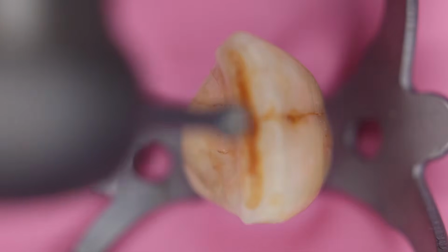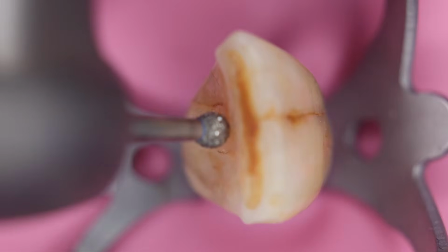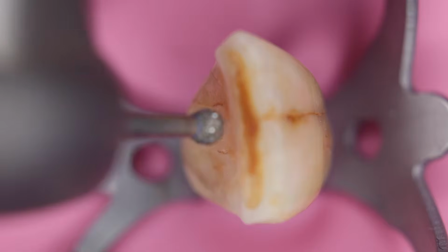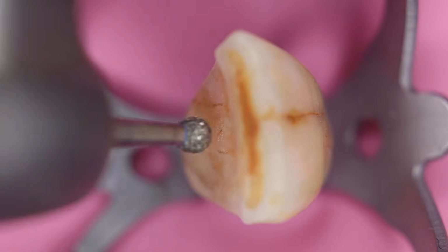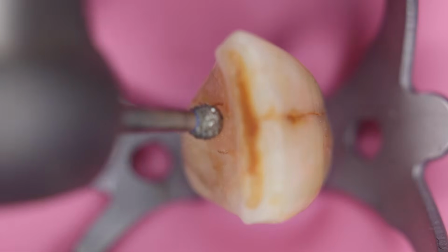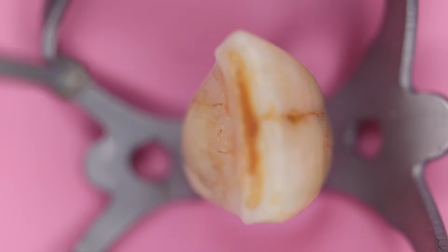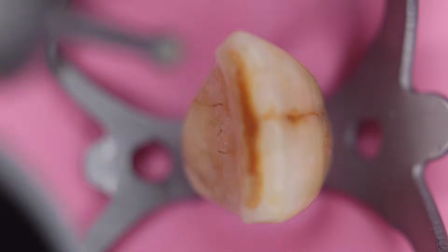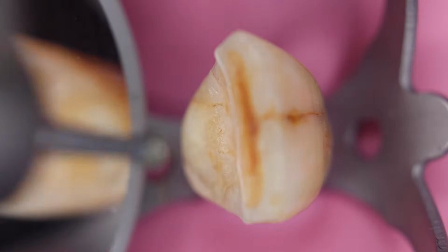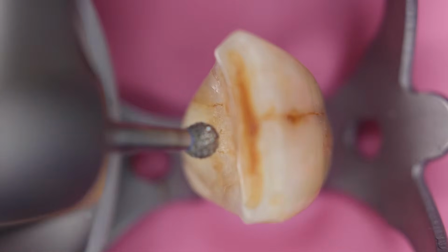Do not perforate it completely, so that it comes out like this. Consider this head, which is roughly around 2 to 2.5 millimeters. So this head should go at this aspect, above the cingulum and well below the incisal edge. So let us begin in indirect vision, keeping the angulation at 45 degrees.